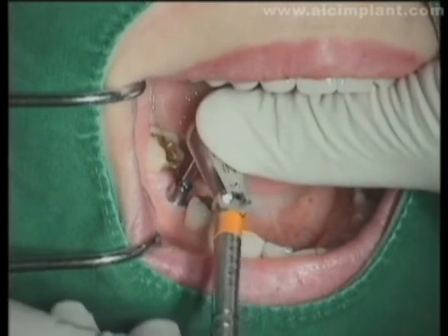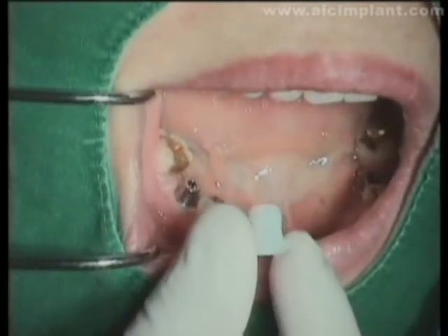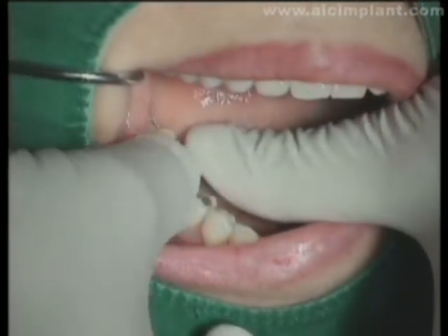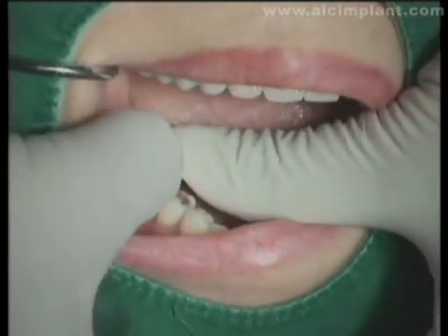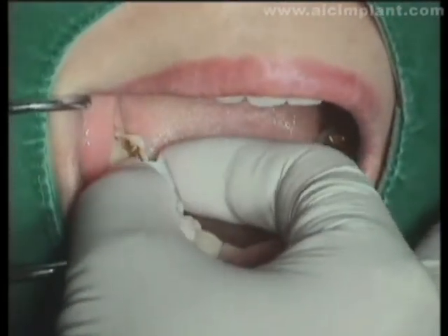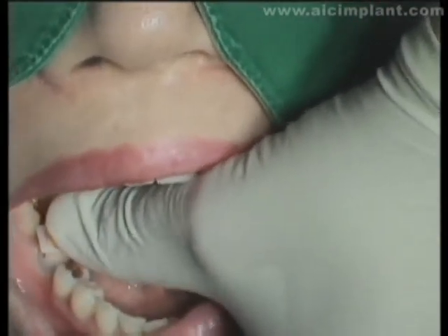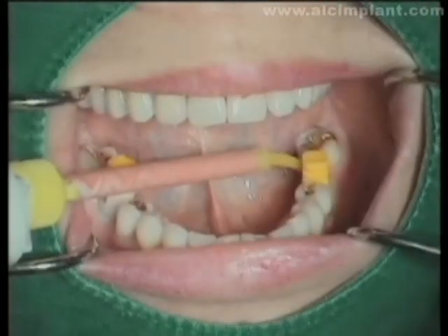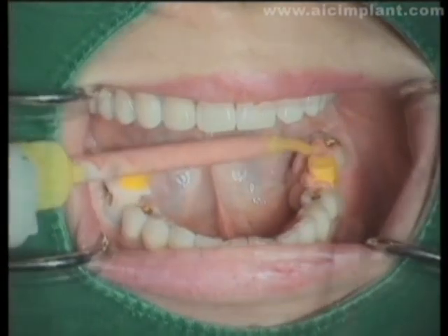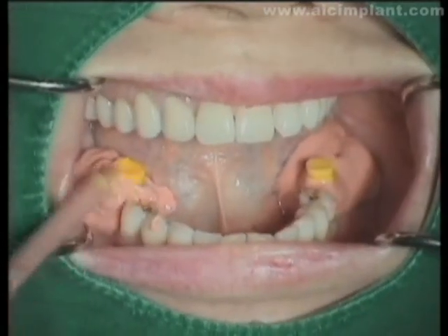A 4 millimeter excellent solid abutment has been connected. The impression cap is connected in the original position. Afterward, the positioning cylinder is attached in the correct position. Impression taking then follows. Impression taking will be done using rubber impression material.